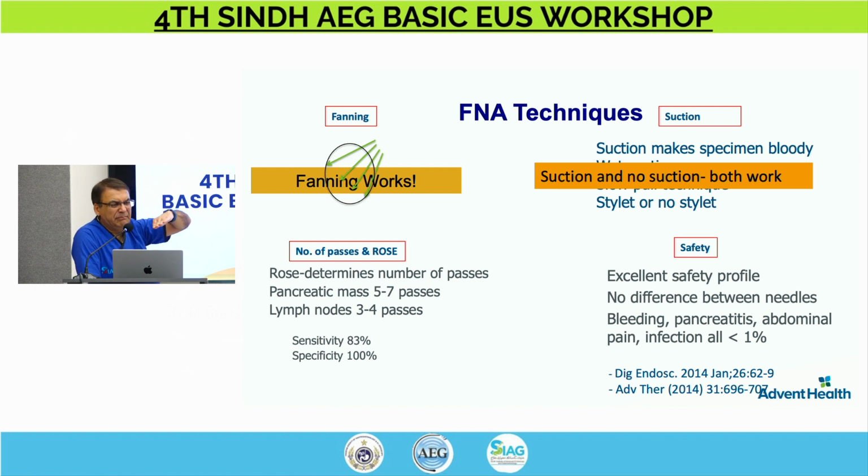Then bring the needle back, not out of the lesion, bring the needle back to the surface of the lesion. Ideally, for me, the first thing I use is maybe move the wheel a little bit away from me or towards me, and then go in the lesion. Even if I don't see the needle completely, by changing the direction with the wheel, that would take me into the different area of the lesion. So I'm not just going back and forth into the same area.